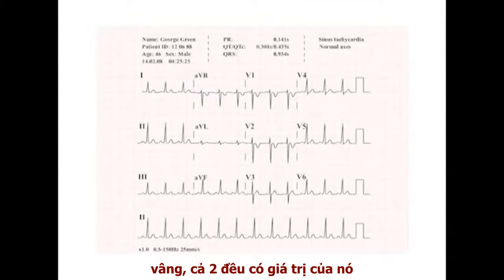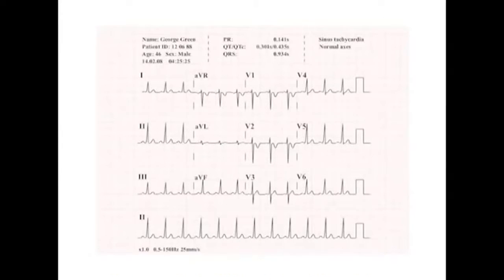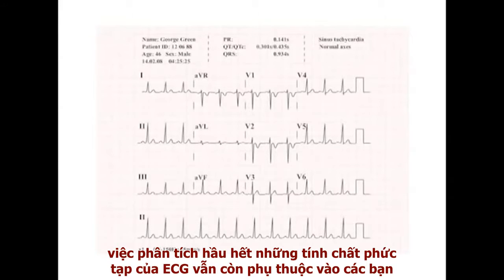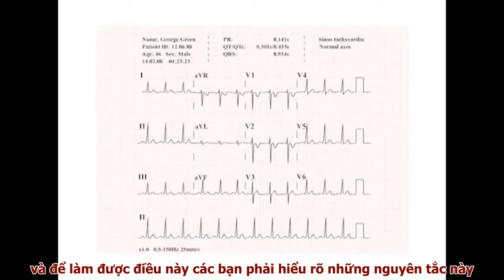Well, both have merits, but it is important to realize that the computer analysis has its own difficulties and limitations. At the present time, the analysis of the most complex of ECGs still rests with you, so you must be able to do it from basic principles. And to do so, you must understand or at least be aware of these principles.